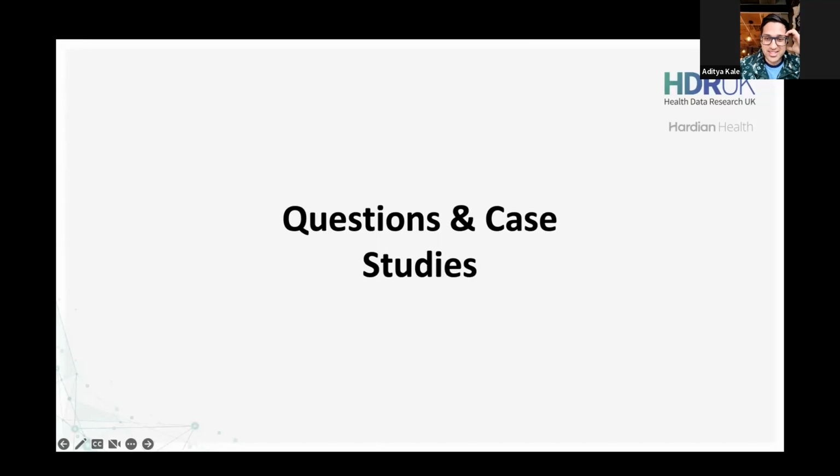So yeah, thank you. Great questions. Digital therapeutics are, by their definition, intending to provide therapy, so they're trying to change a treatment outcome. And so the adverse event can be that the treatment outcome is suboptimal or incorrect, or at least a harm. And when you're designing your regulatory documentation and indeed your clinical follow-up, you should have documented what you will define as an adverse event as opposed to a serious adverse event.